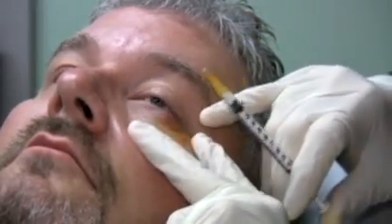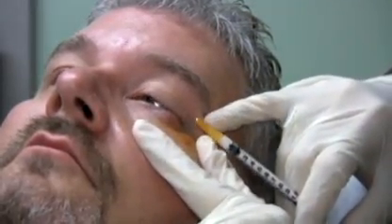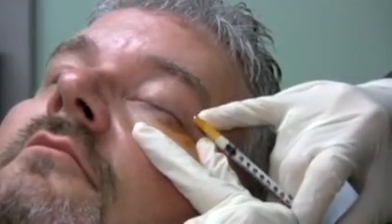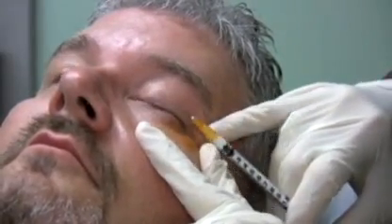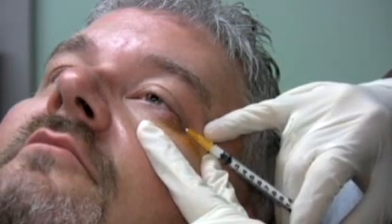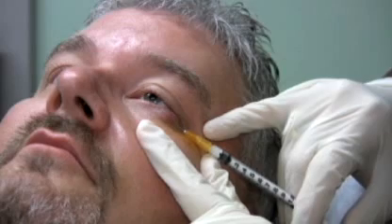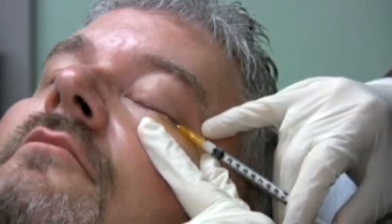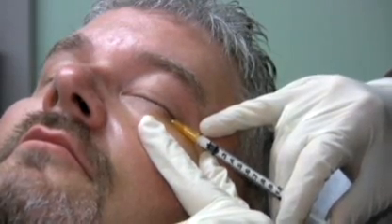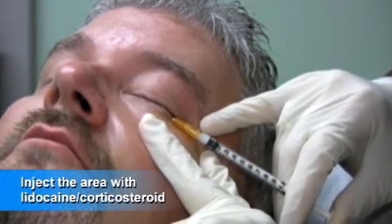I'm going to put a little traction here just to stabilize that. Our goal is to go parallel to the eye, right into the nodule itself. Are you okay? Okay. Here we go — you'll feel a little prick right here. I can actually feel it in there.